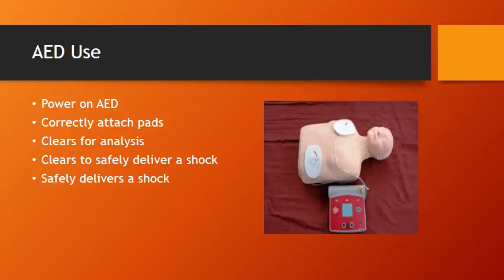You see we have one pad on the right upper chest, and our next pad on the lower portion of the left side.